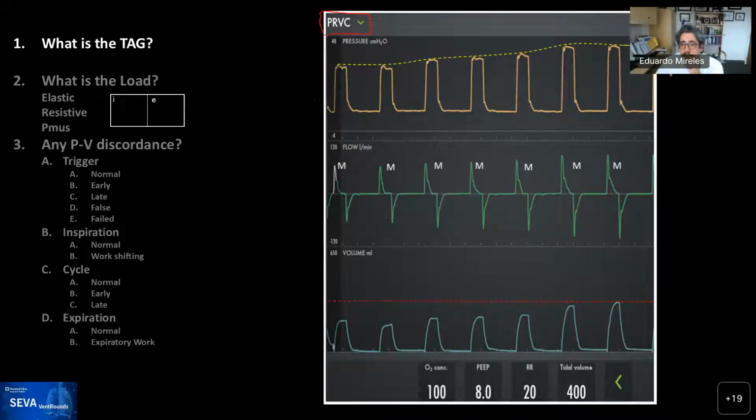So I'll put the options here. So it's either PC or VC. Is it either CMV, CSV, IMV, or if it's set point, dual, servo, adaptive, optimal, biovariable, or intelligent. So rapidly, some answers are coming in. Have no fear. Enter your thoughts. And if you don't agree with the person that entered them, that's okay.